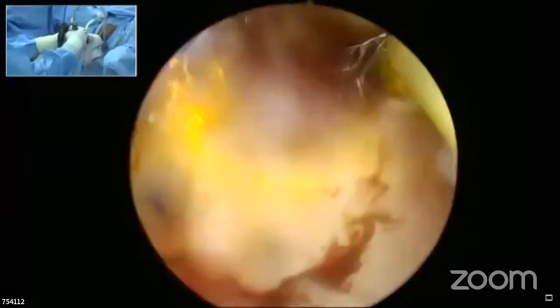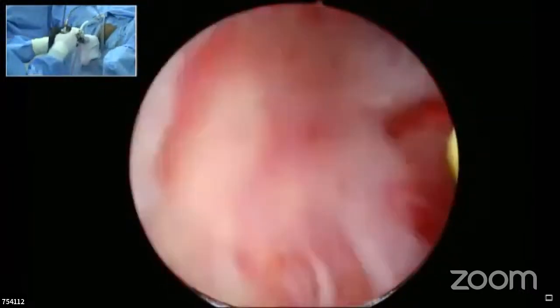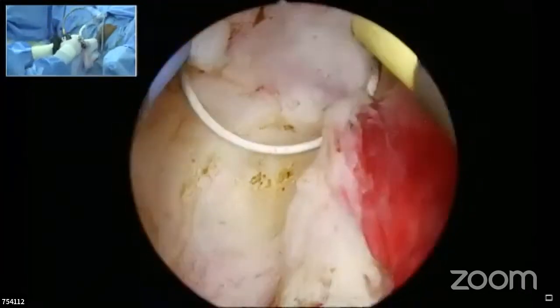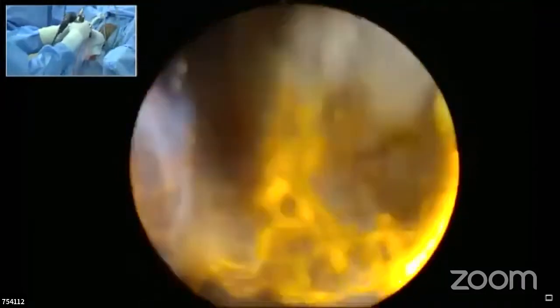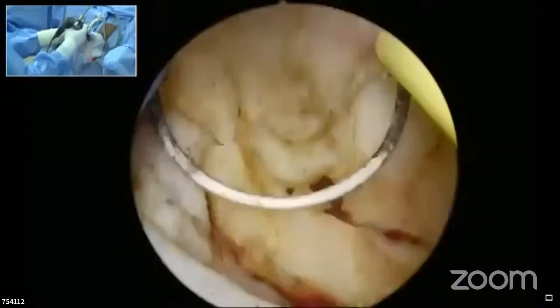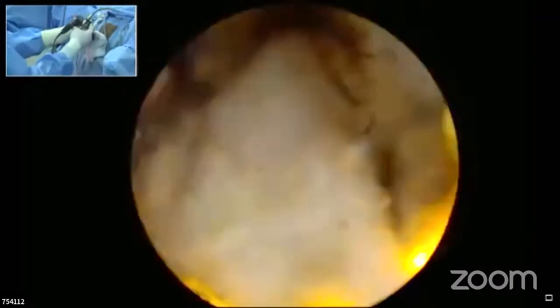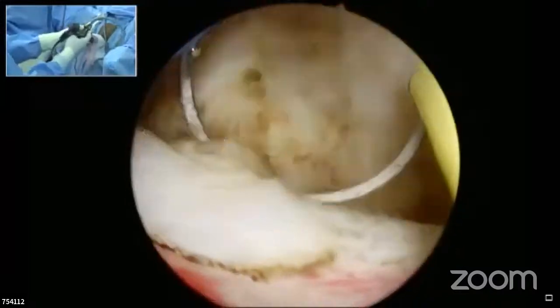Or glands coming beyond the verumontanum. I think this is a crucial area. Kirpekar sir, any specific techniques you adopt? Anything specific that I do? No, just be more careful, work with low bladder volume so that the apex comes to you much more clearly.